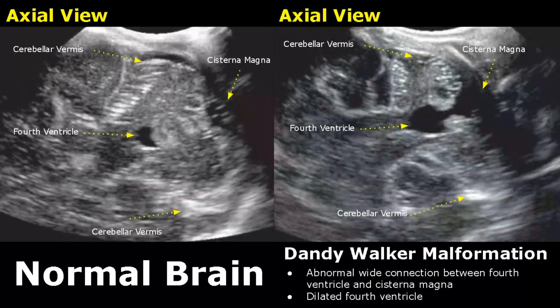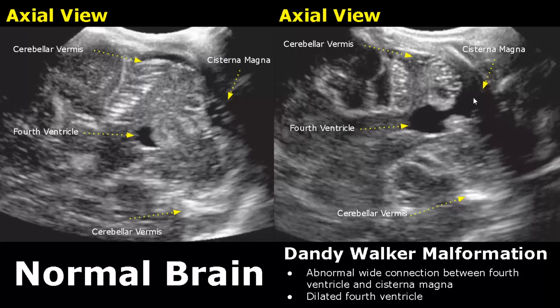This is an axial view of a normal brain showing the cerebellum, the fourth ventricle, and the hyperechoic cerebellar vermis. This anechoic region is the cisterna magna. In Dandy-Walker malformation there is an abnormal wide connection between the fourth ventricle and cisterna magna, and the fourth ventricle is dilated.